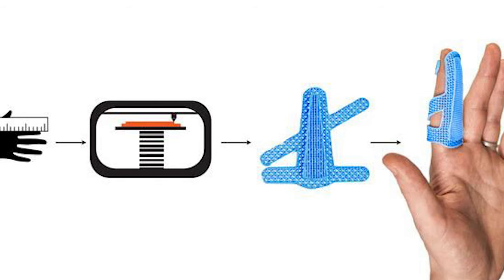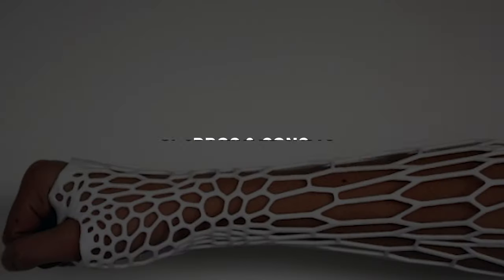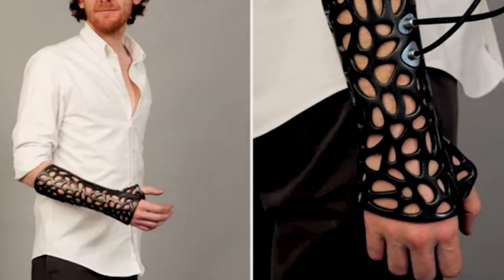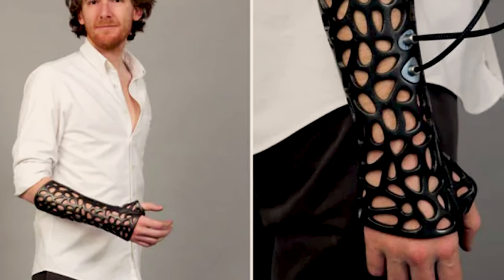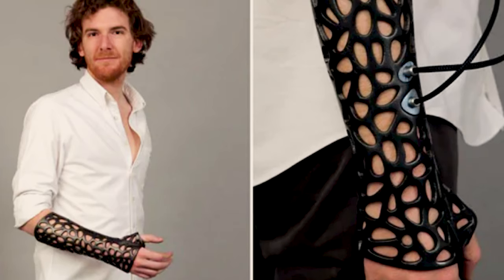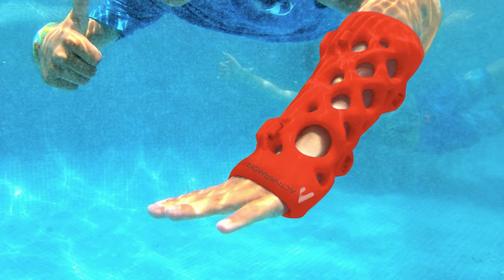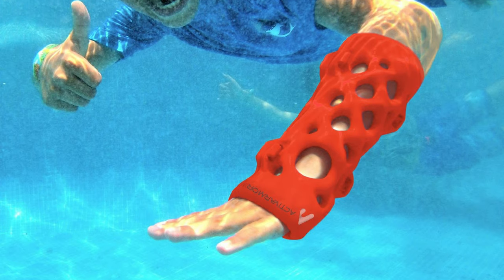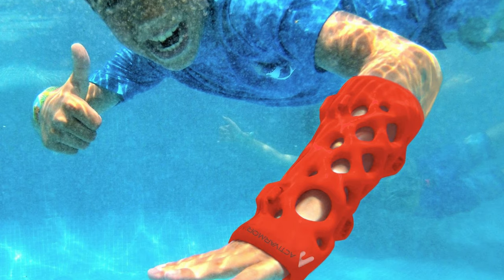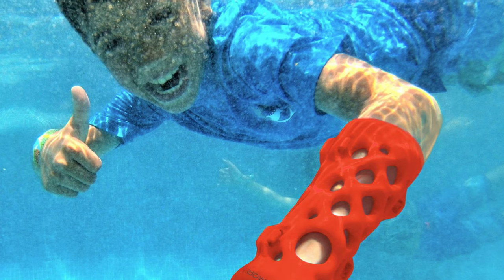As we wind up, let's look at the pros and cons of 3D printed orthopedic casts. The main advantages of 3D printed casts include patient comfort, easy application and removal, as well as lower costs compared to a plaster cast. Individual modeling of the 3D printed orthopedic cast makes the treatment process much more efficient. Moreover, the open lattice structure improves breathability, which is especially important when treating children.